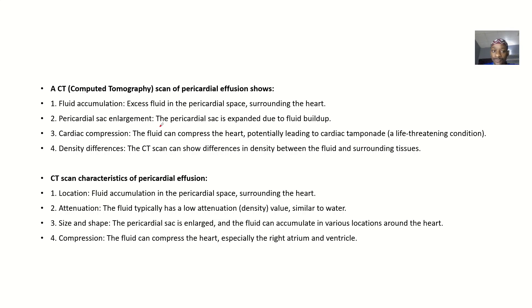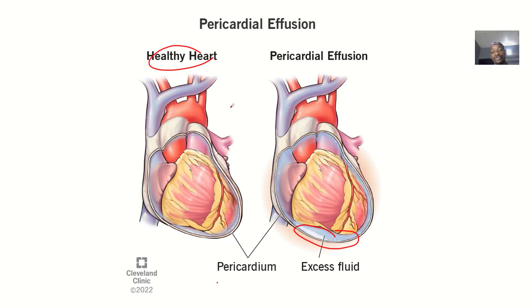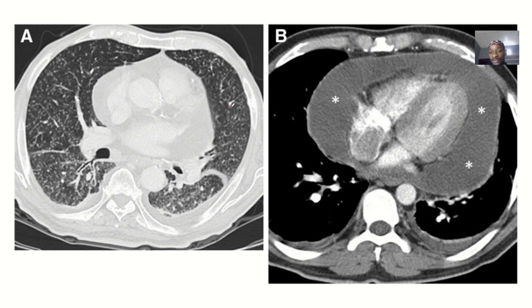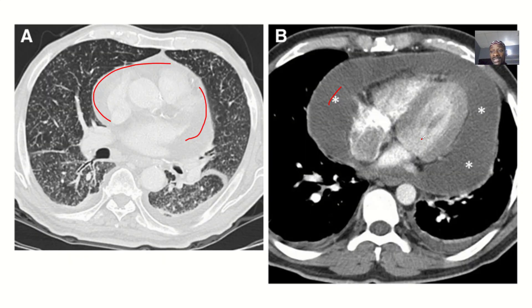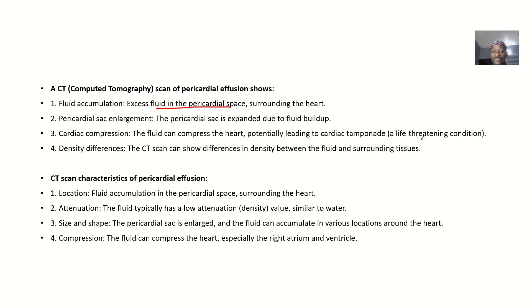A CT scan or computed tomography scan of pericardial effusion may show the following. There will be fluid accumulation — that's excess fluid in the pericardial space surrounding the heart. It shows excess fluid in the pericardium surrounding the heart. This is a very big enlarged heart and I can see fluid surrounding it. The pericardial sac will be enlarged due to fluid buildup.